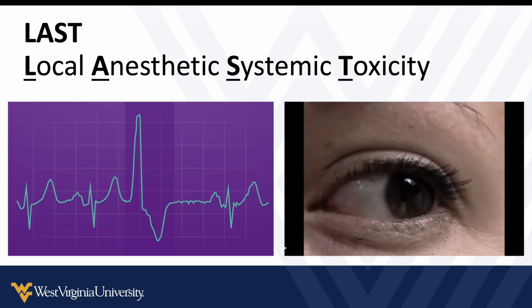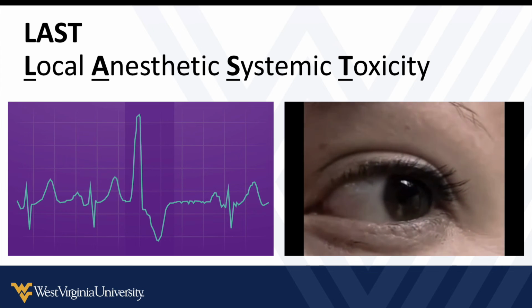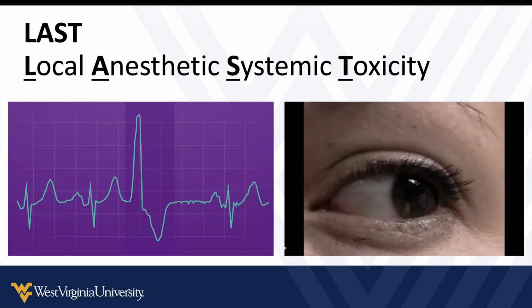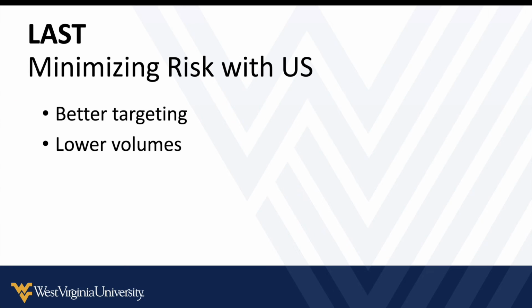And if they get these things, and you're still injecting and some of this happens, you certainly want to stop the injection. Most likely this is going to happen after you've finished the injection, and you want to be ready to treat this. And we'll talk about the treatment here in just a second.